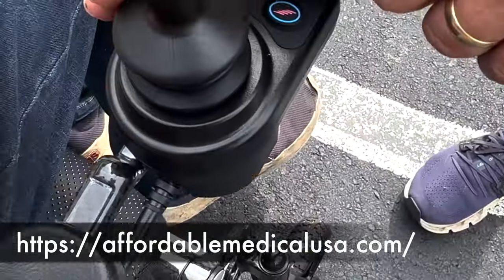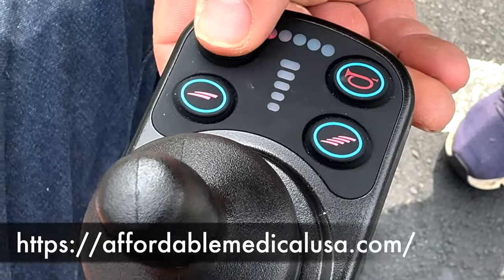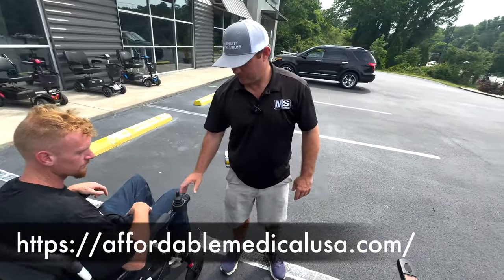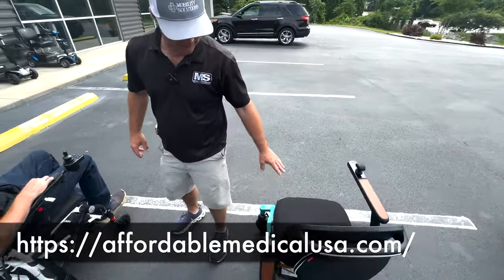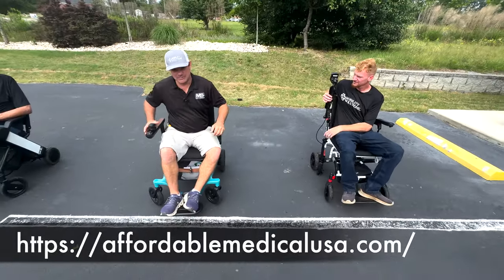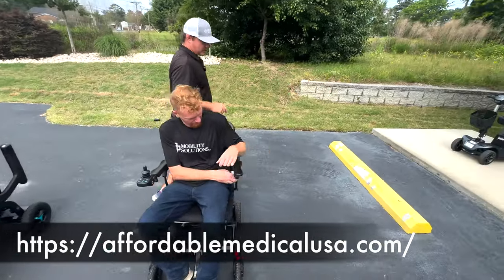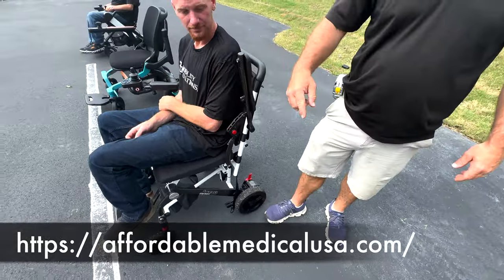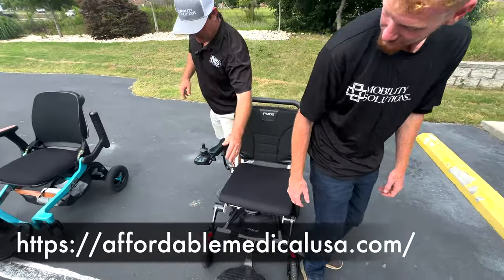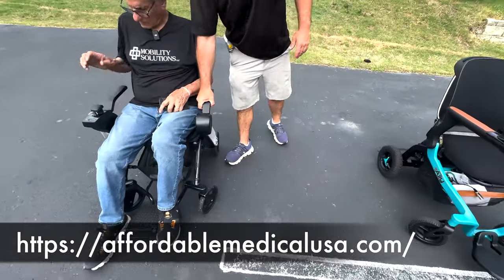Over here, you got your speed. It beeps. Power button, horn. You don't wanna put a lot of weight on this to get up. Getting into these can be a little bit easier if you don't want to do the foot plate by like this and coming around and bringing this down. It's easy movement. You can put your hands here, put your hands back here to get up. You can do the same thing with this one. It's flipping that back. Turn this way, Josh. And come right out. So if you don't feel like bending over and grabbing those foot plates, you don't have to if you do this. This one, they don't come up.